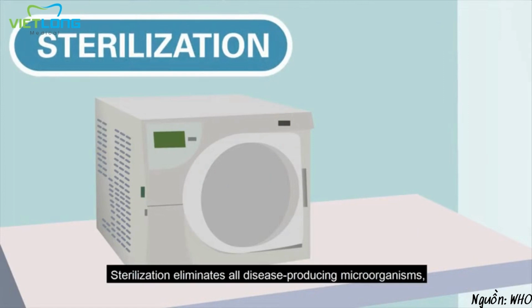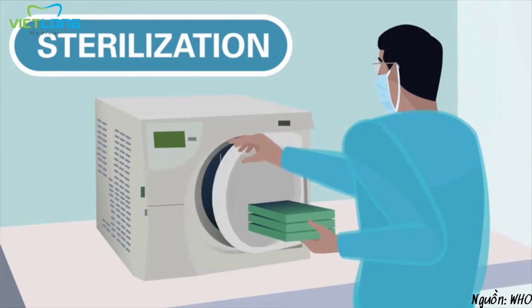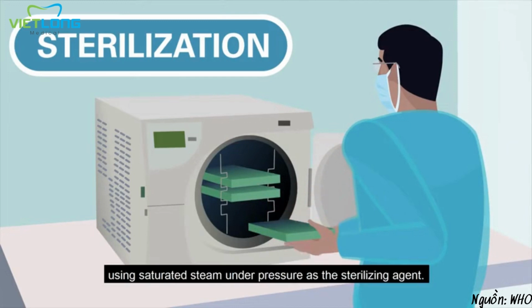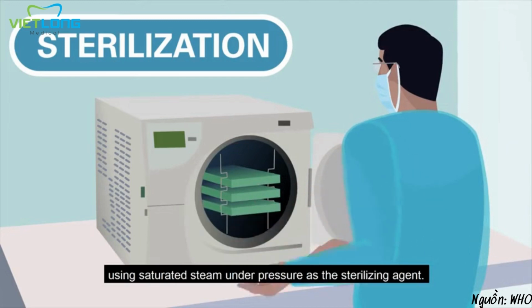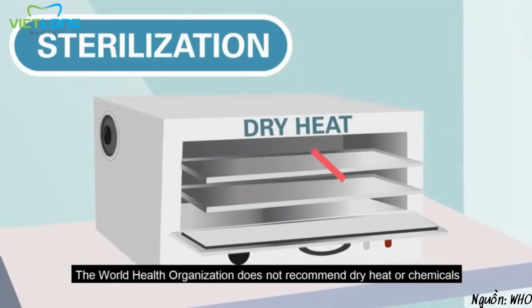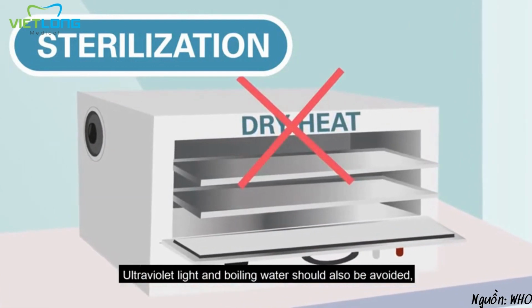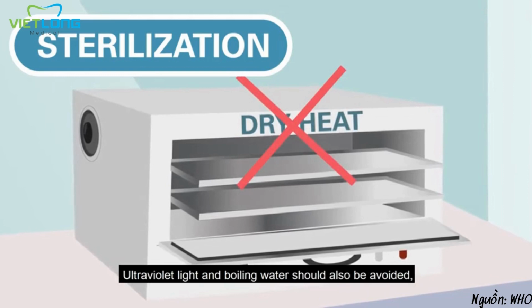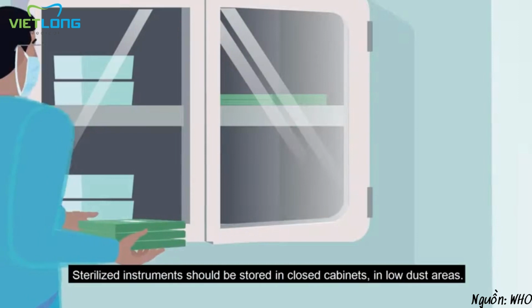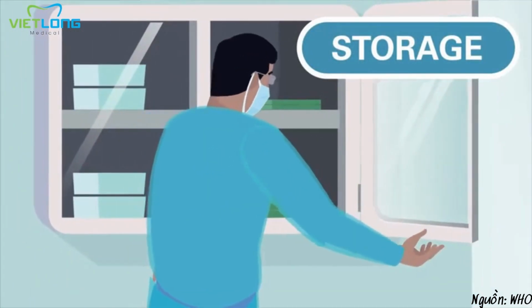Sterilization eliminates all disease-producing microorganisms, including the COVID-19 virus. For dental instruments, the preferred method is steam sterilization, using saturated steam under pressure as a sterilizing agent. The World Health Organization does not recommend dry heat or chemicals for the routine sterilization of dental instruments. Ultraviolet light and boiling water should also be avoided, as they do not sterilize instruments. Sterilized instruments should be stored in closed cabinets in low-dust areas.